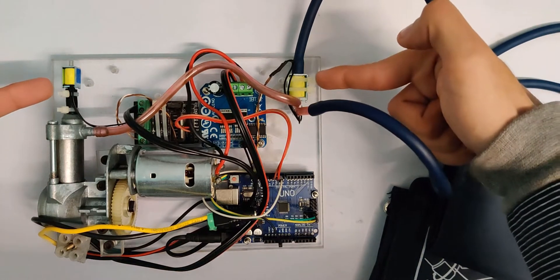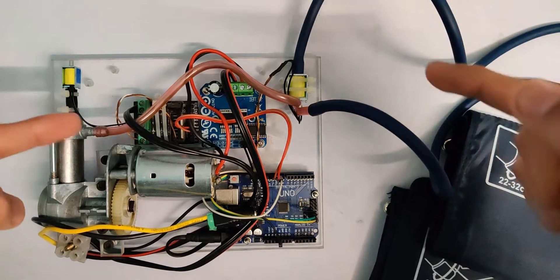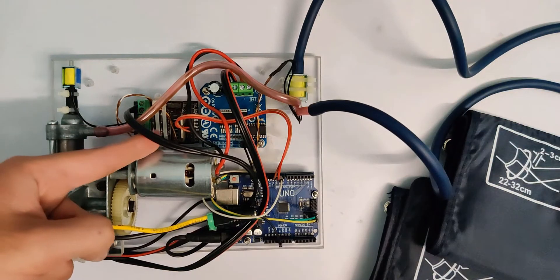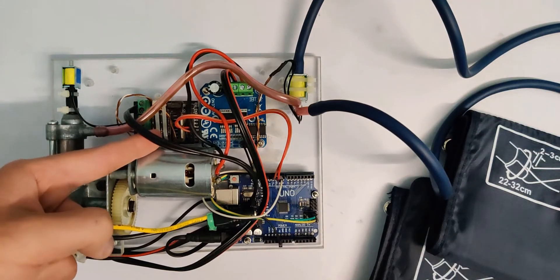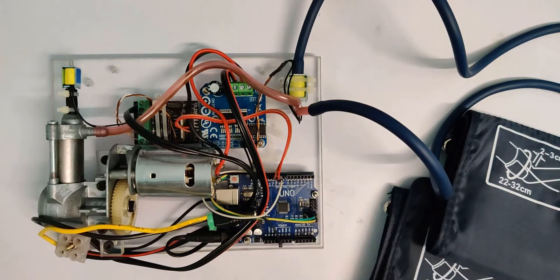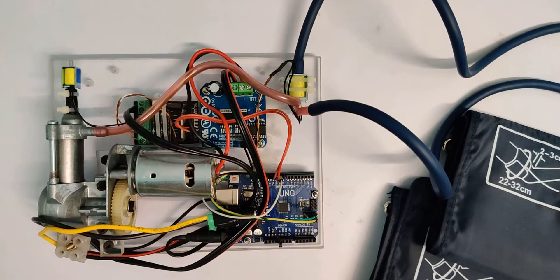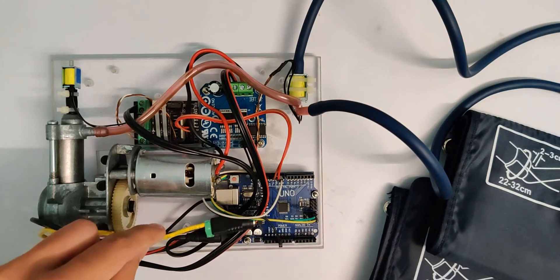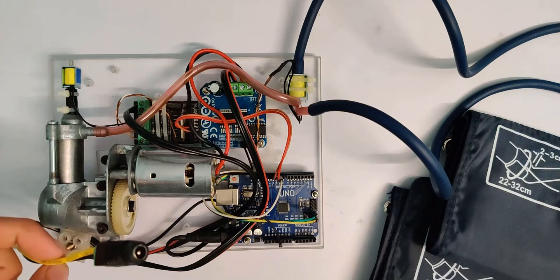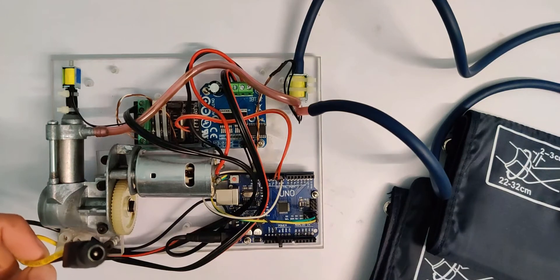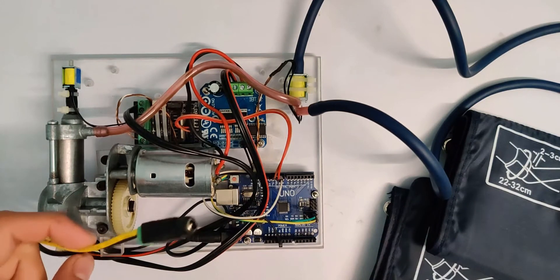Both these solenoid valves are being controlled by this dual H-bridge motor driver. You can use a transistor or a relay to control them but I used a motor driver to reduce my work. And at last I have this 12 volt power input to power the whole circuit.